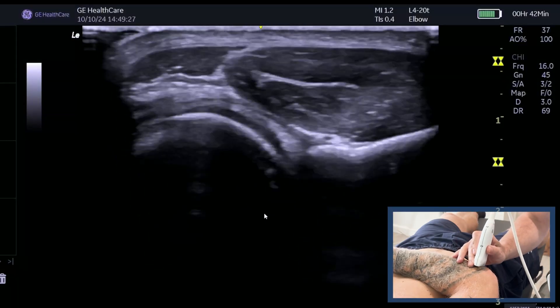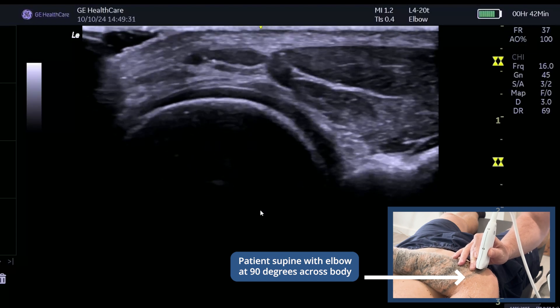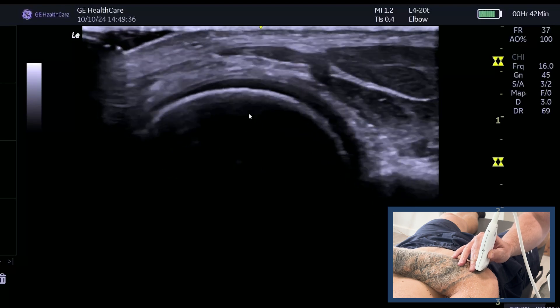Now we're going to show you how to find the distal biceps using the Cobra approach, demonstrating both long and transverse views. Lots of people forget to do the transverse view, but it actually shows the structure really nicely.